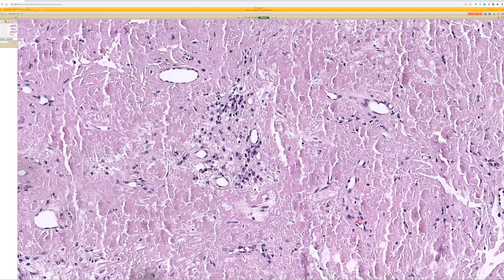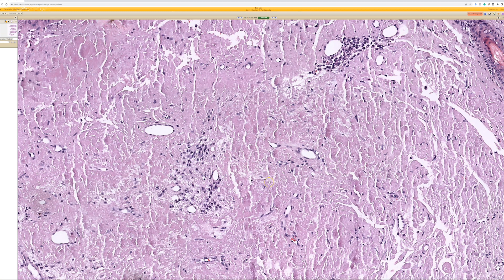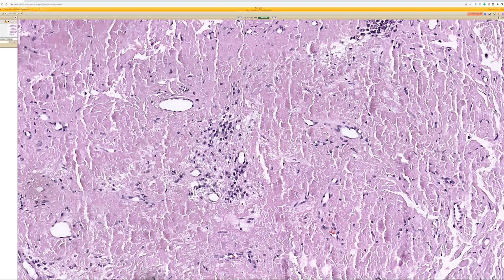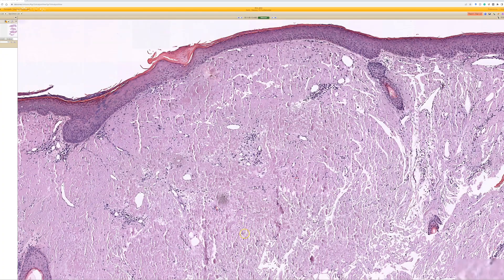These plasma cells, I believe, will show up as clonal on kappa and lambda in situ hybridization — they usually are clonal plasma cells depositing light chains as amyloid, but it's just building up in the skin. That's the kind of process I go through to work it up, and I usually have to write a comment to explain. Systemic amyloid can absolutely make nodules that look just like nodular amyloid. The only way to distinguish definitively is to do the bone marrow biopsy and additional clinical workup to exclude systemic amyloid, but one clue is the presence of plasma cells in the infiltrate.